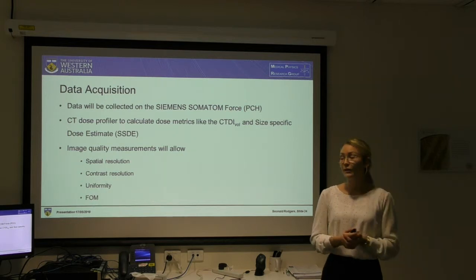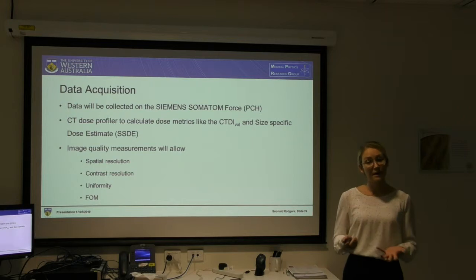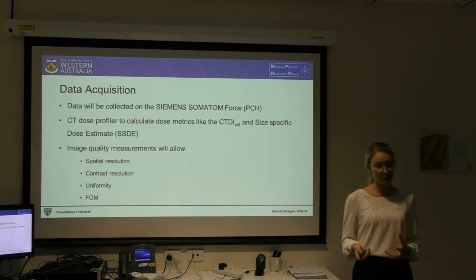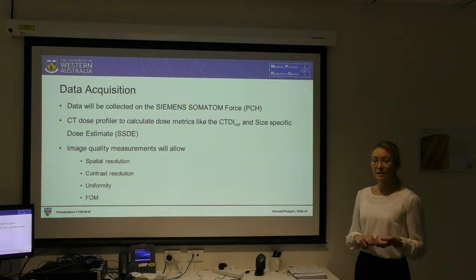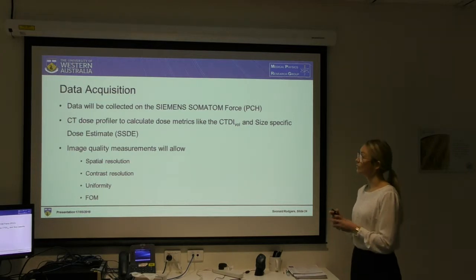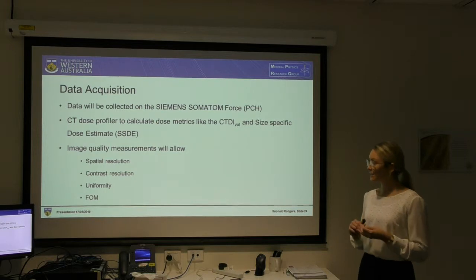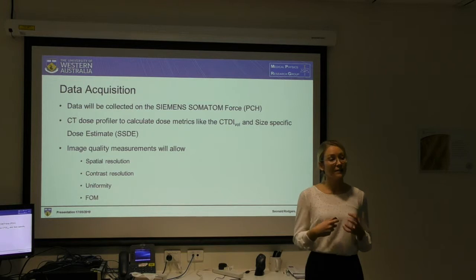The data acquisition phase will involve measurements being made on the Siemens Somatom Force located at Perth Children's Hospital. A CT dose profiler will be used to take dosimetry measurements used to estimate dose metrics such as the CTDIvol and the size-specific dose estimate. Image quality measurements will be taken to allow the analysis of spatial contrast resolution, uniformity, and a figure of merit.